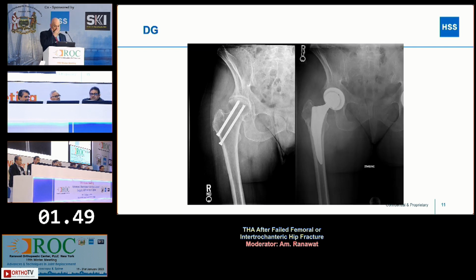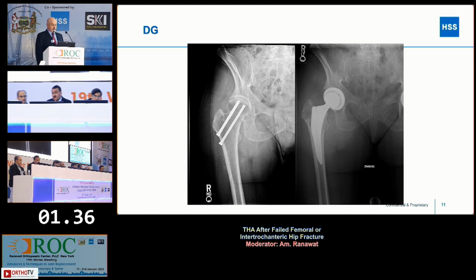All right, here are some cannulated screws. Who wants to take it on? Dr. Sharma? The plan will be dislocation of the hip first, and then taking out the screws after cutting the neck, and then the high-speed burr. It is a very useful device in all these cases. You make the right entry point with the burr, and then go on with the routine hip arthroplasty.